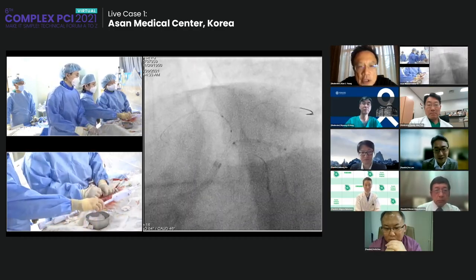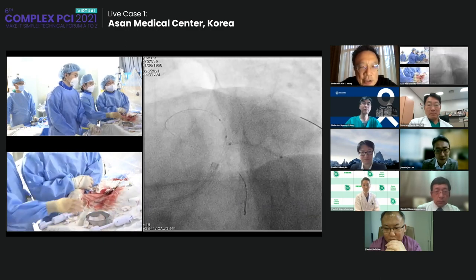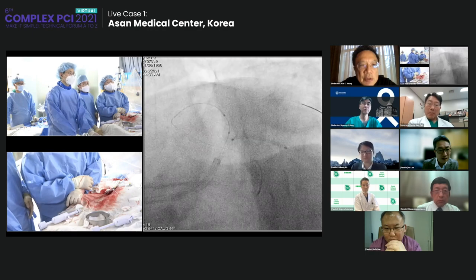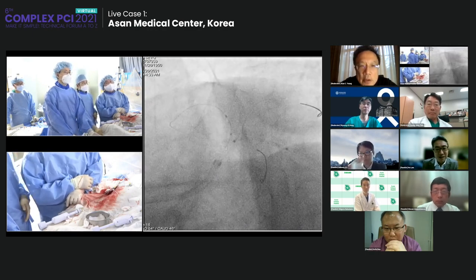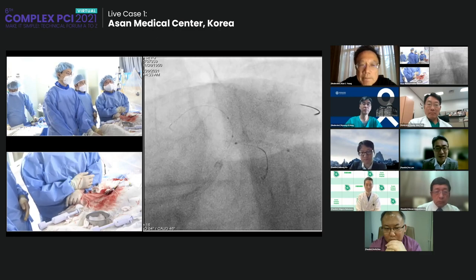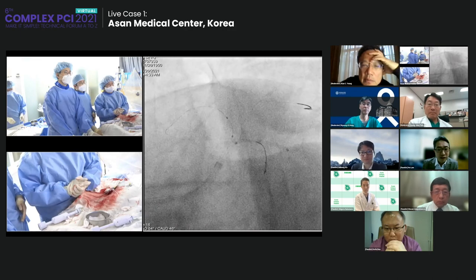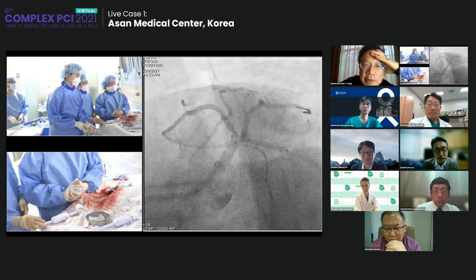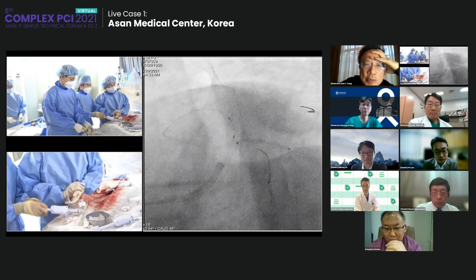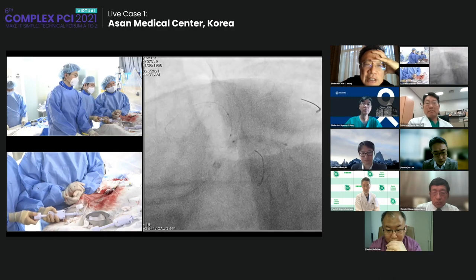So, Zhen Ming, are you going to use the same technique, where you fully dilate the circumflex stent with the NC balloon before crush? Yes. I think this is very useful and very simple to make a perfect apposition of the circumflex ostium. I think that technique would be especially helpful. Let's say there is actually a severe stenosis in that obtuse marginal branch. Then now you have to deal with stenting that as well, right?